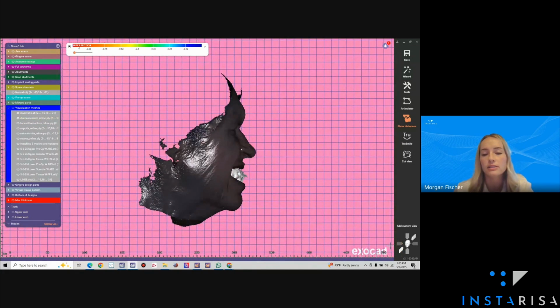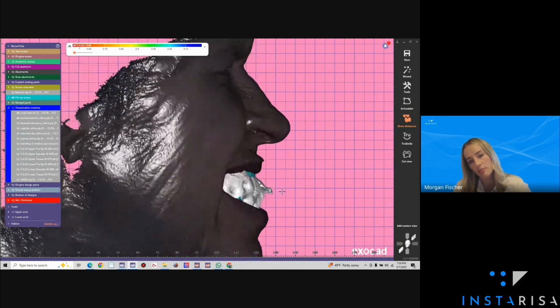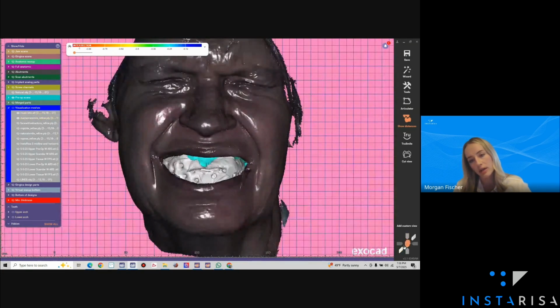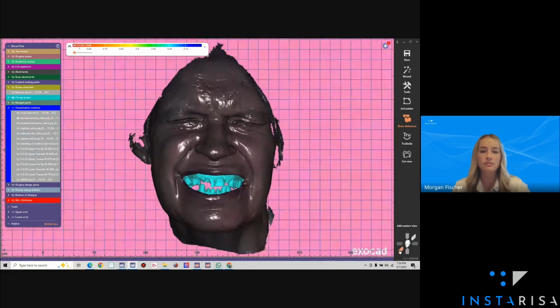Another note, when you're taking these facial scans, if you are taking a putty bite or a mush bite, you really want the lip positions to be in the ideal position. So like here, it looks like the putty bite might have gotten a little thick. We're getting curvature here in the lip. So I know that this preoperative lip position is probably a lot thicker than what it's actually going to be without the putty. So we just want to make sure that we're trimming these things back and all of our lip positions are exactly where they're going to be, so I have a better idea of where to wax everything up.